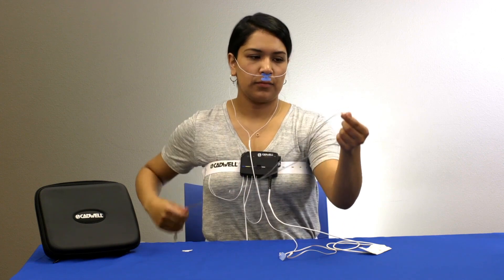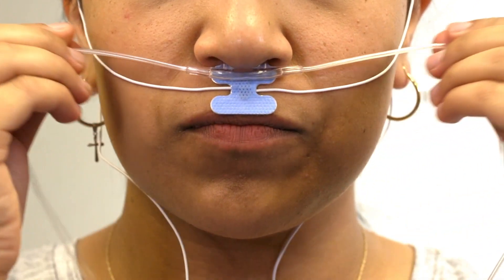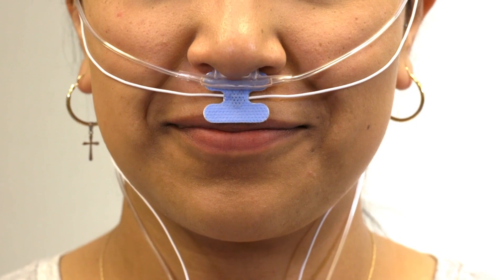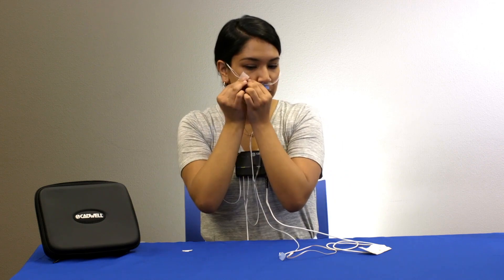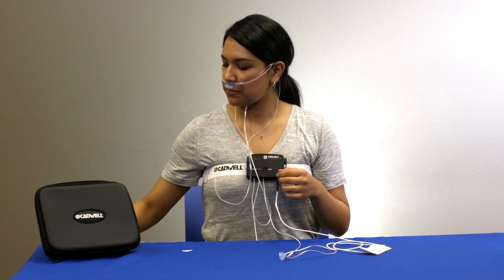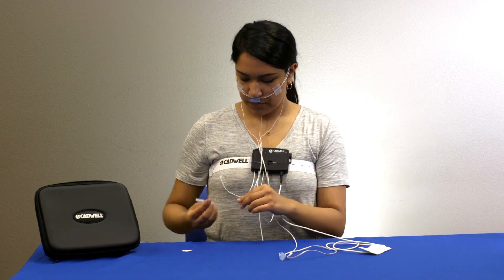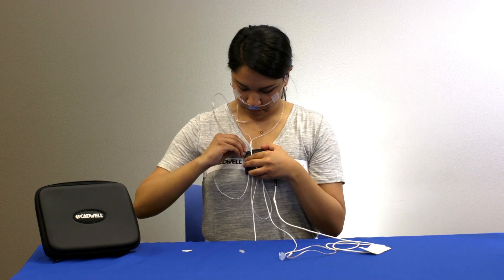Holding the cannula with the prongs facing towards you and curving down, insert the ends of the prongs into your nose and pull the cannula tube back over your ears like a pair of glasses. Slide the tension adjusters up the cannula tubing. Tear off two small pieces of tape and secure the tubing to your cheeks. Attach the cannula by gently twisting the tube onto the metal connector on the top of the apnea track.